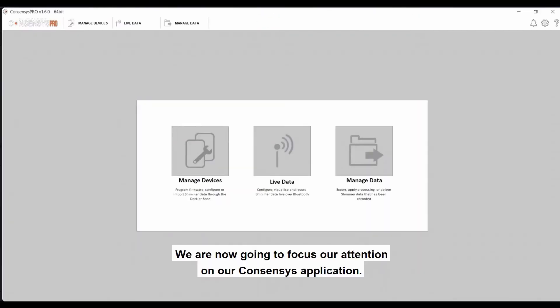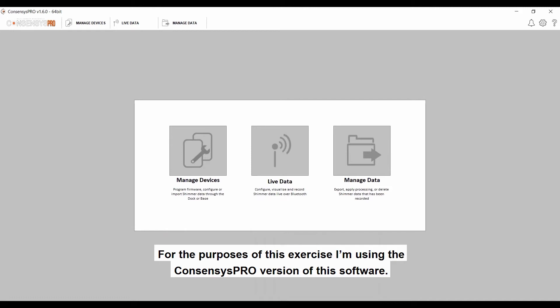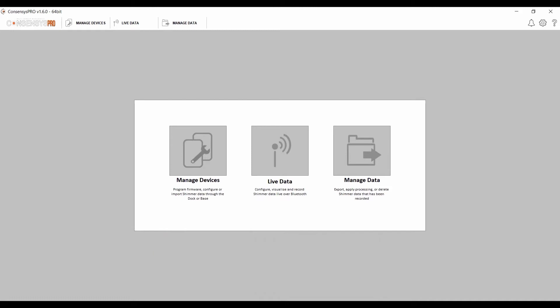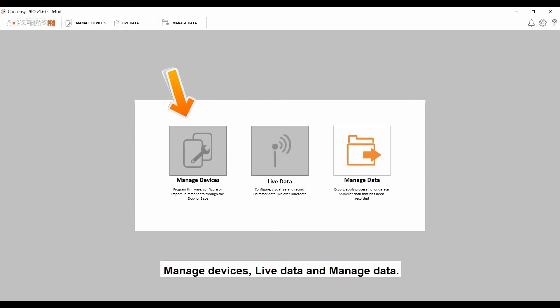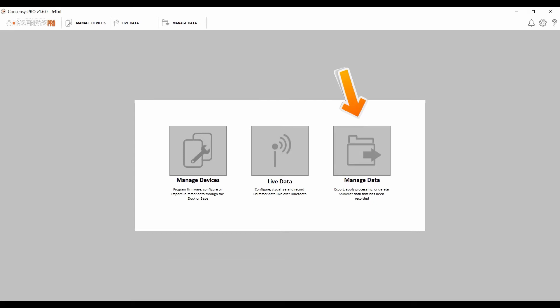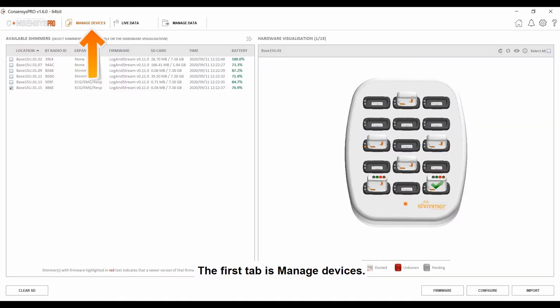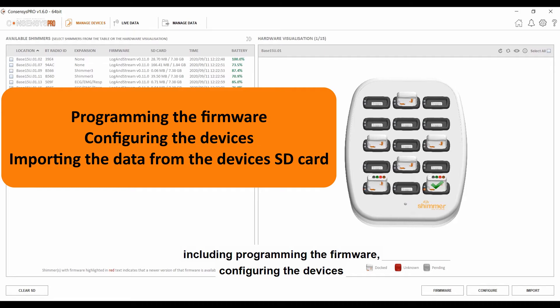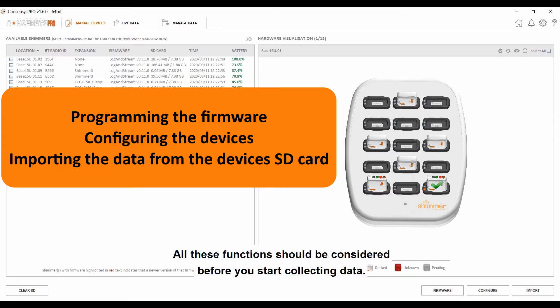We are now going to focus on our Consensus application. I'm using the Consensus Pro version of this software. When you start the application, you are presented with three core tabs: Manage Devices, Live Data, and Manage Data. The first tab is Manage Devices. This tab is essential for when you are starting your trial, as it allows you to perform a number of functions including programming the firmware, configuring the devices, and importing the data from the device's SD card. All of these functions should be considered before you start collecting data.